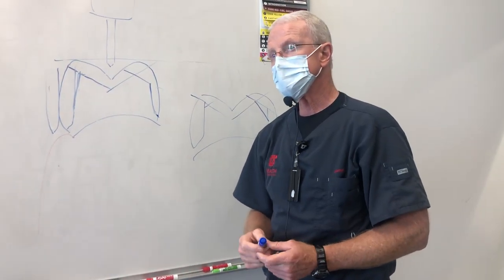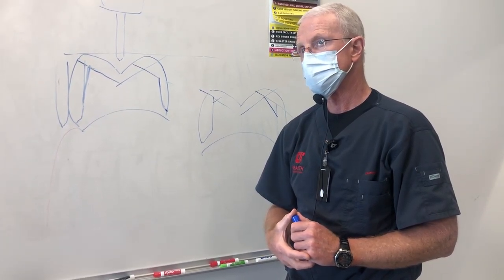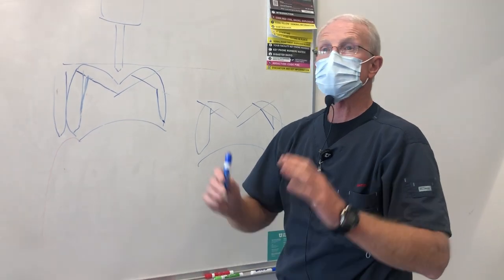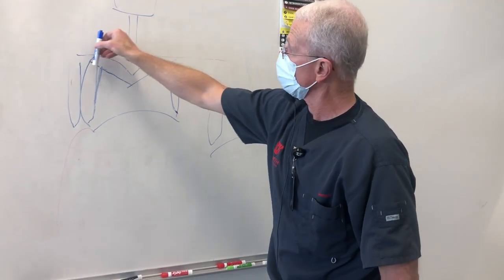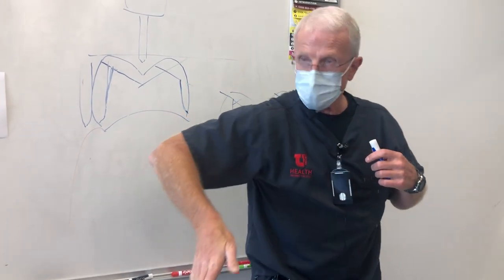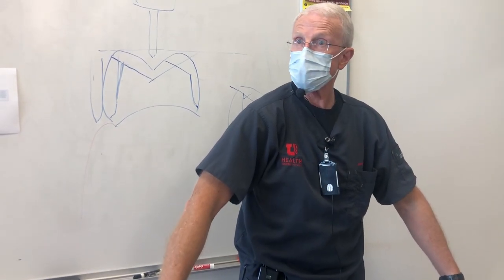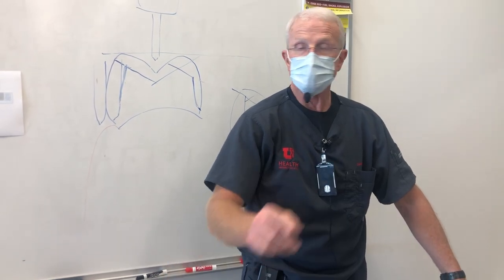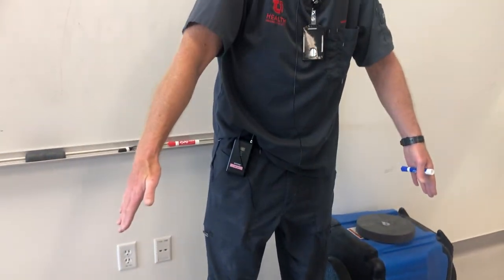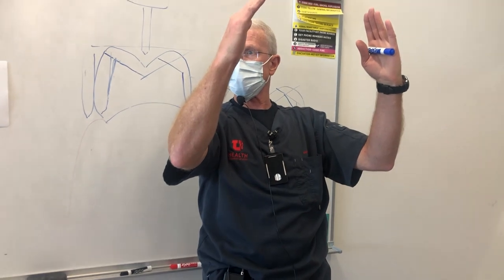In the mandibular preps, I remember you told us to try to tilt the prep lingually because of the curve of Wilson. How does the curve of Wilson affect our axis in maxillary preps? Exactly the same concept, but when you line up with the axis of the tooth, this handpiece is actually going to be sticking out to the buccal a little bit because of the curve of Wilson. Your upper molars, for most people you're treating, and certainly on your typodonts, the uppers are like this and the lowers are like this. Does that make sense? The uppers are going out to the buccal a little bit, and the lowers are coming into the lingual just a little bit because of the curve of Wilson.